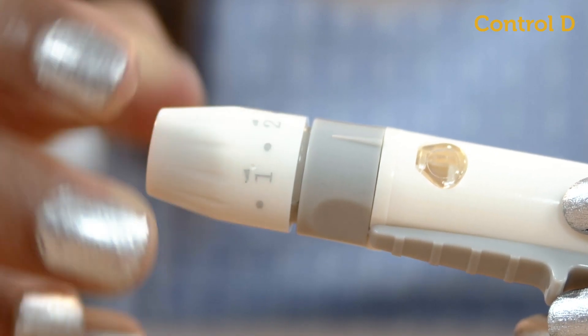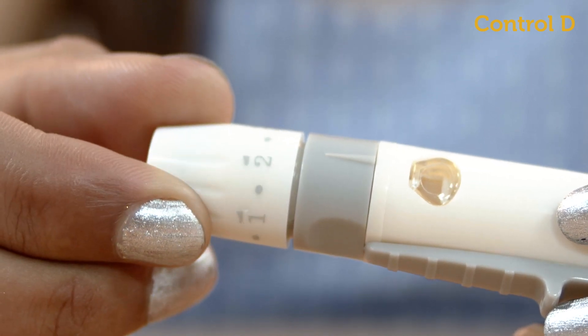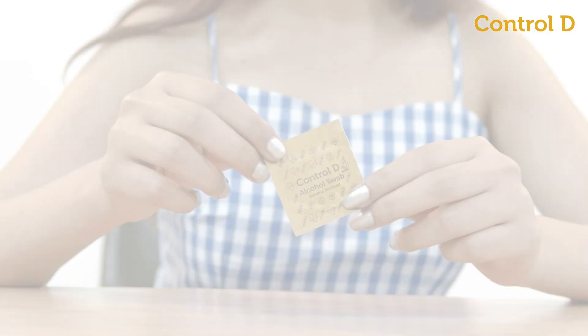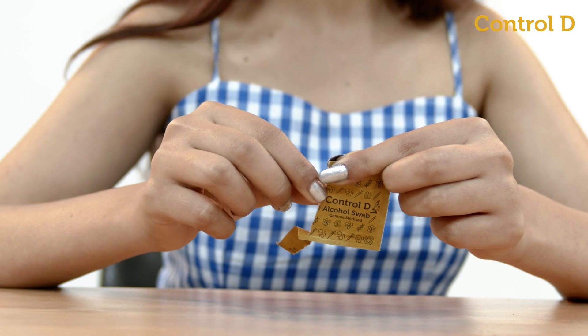Rotate the dial for the pricking depth setting of the lancing device, one being the lowest and five being the maximum pricking depth. Wash and dry your hands, then clean the puncture site with an alcohol swab.